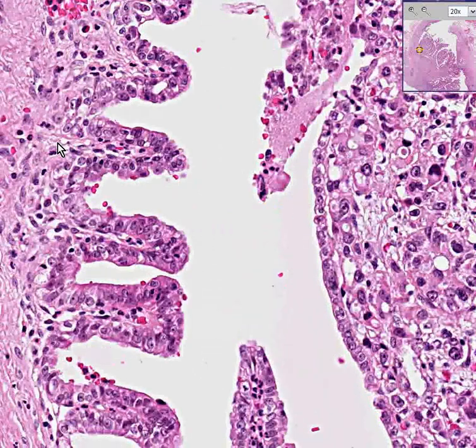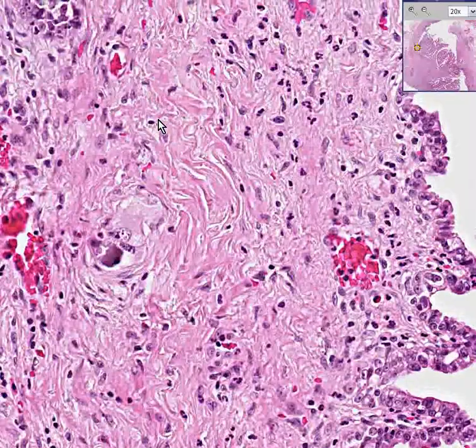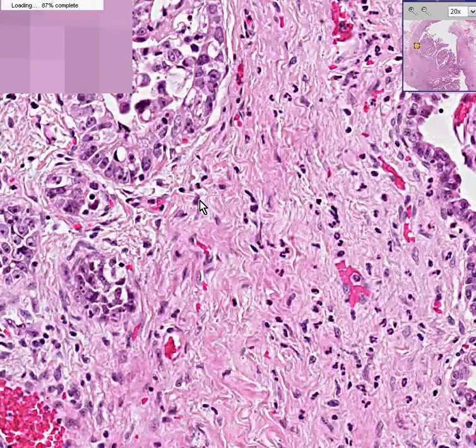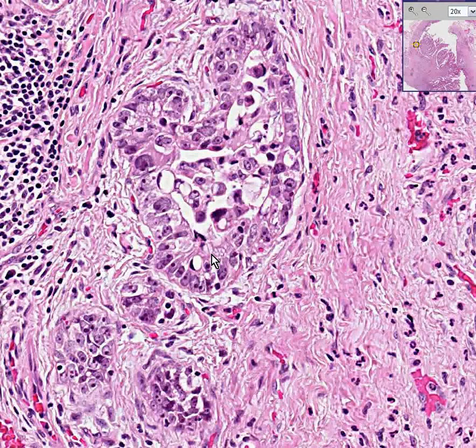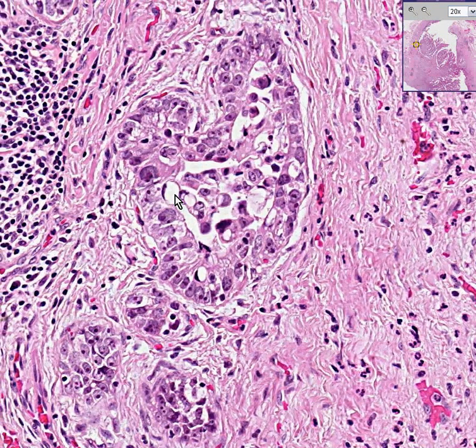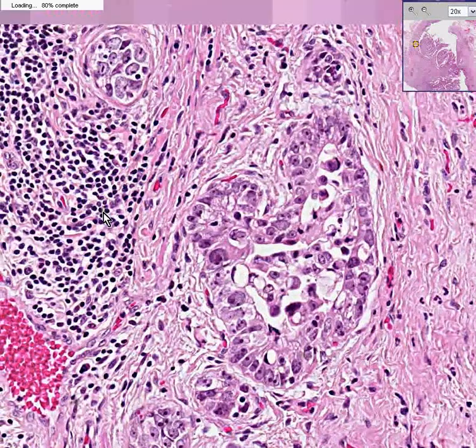Here is the wall of the common bile duct now as well. You could see that some of this tumor has obviously invaded into the wall as well. And if there was any doubt that this was a cancer, just look. There's a gigantic nucleus with a huge nucleolus; the nucleolus of this cell is bigger than the nuclei of most other cells. Here's a very dark, irregular cell with a big vacuole inside of it. And of course, these are just reactions of inflammatory cells within the duct.